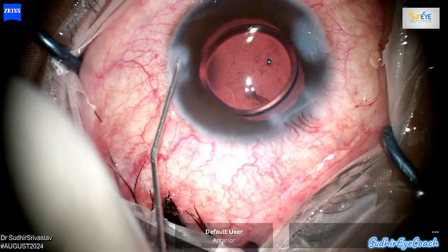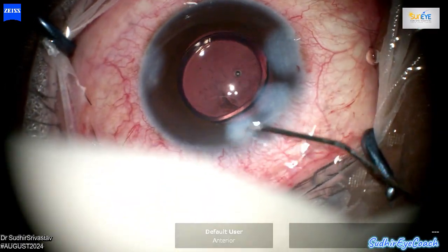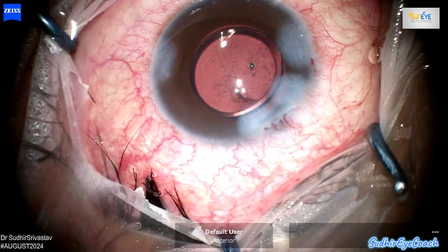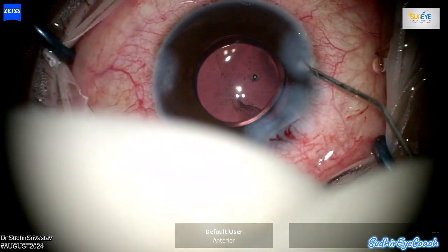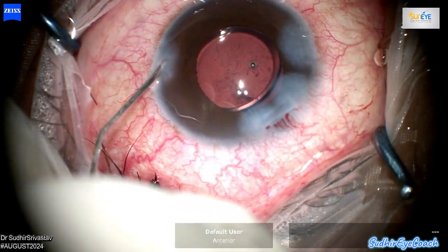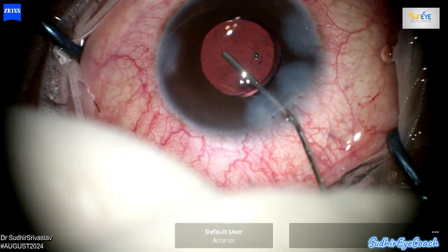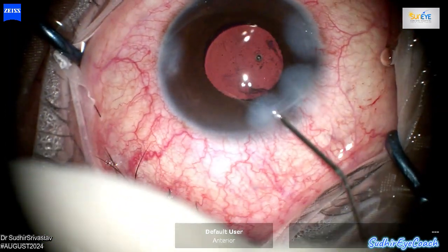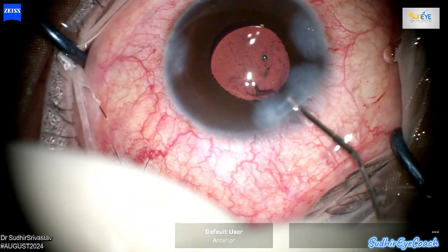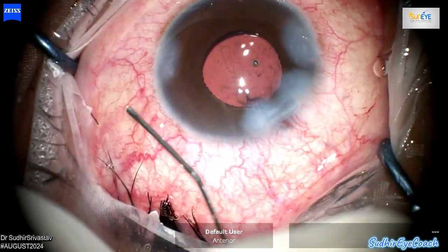With careful pre-operative planning, thorough patient discussion and consent, availability of a variety of IOLs, and proper anesthesia to keep the patient calm and cooperative, we can successfully perform surgeries even in complex cases like posterior polar cataract. There was an elevated intraocular pressure due to fluid that had entered the vitreous cavity. To manage this, we initiated anti-glaucoma oral medication to keep the pressure under control.